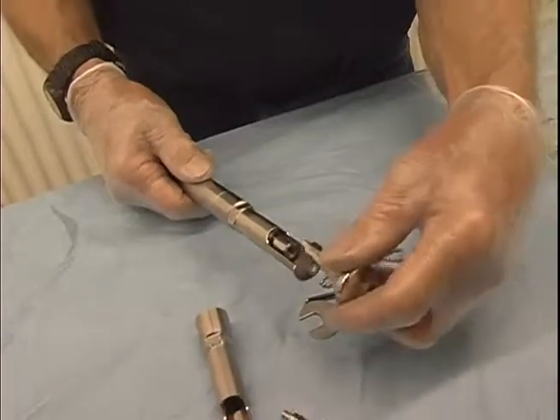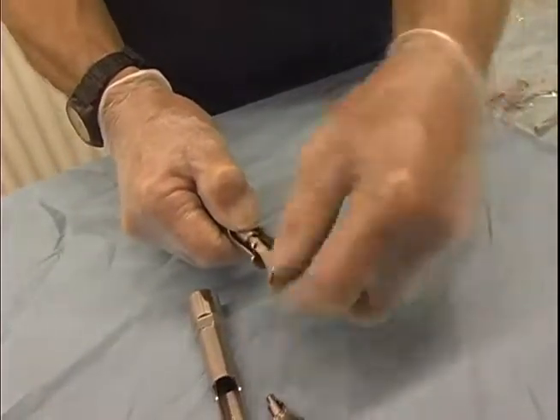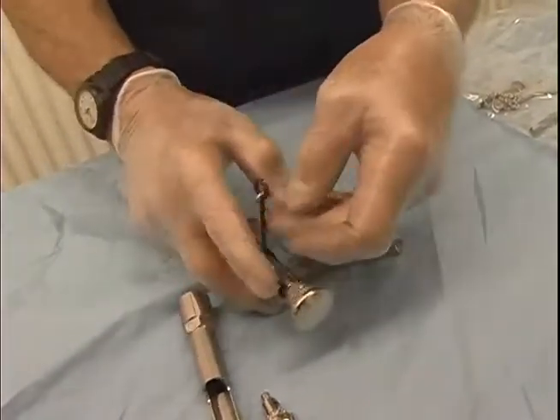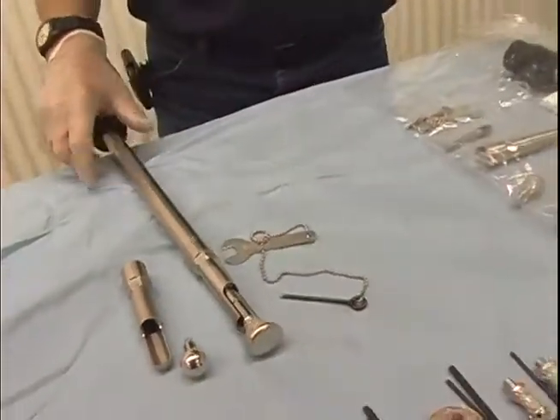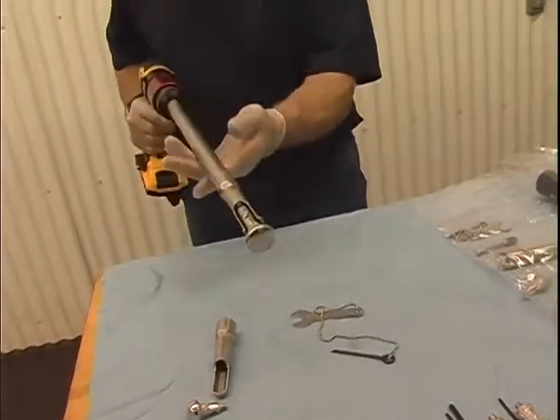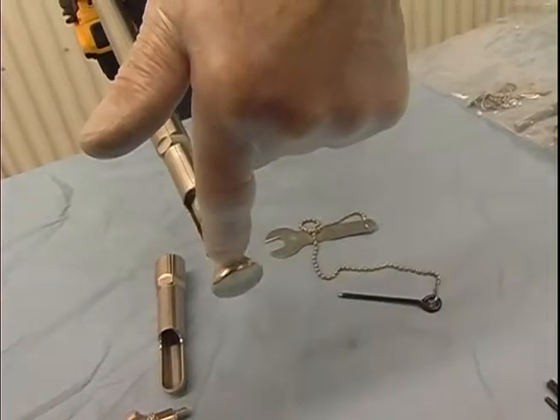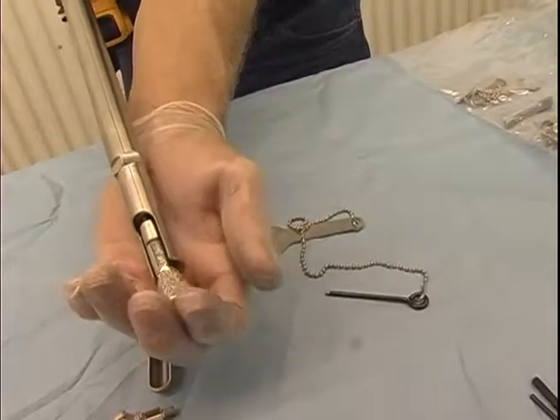And lastly, the flared end burr, the upper 11 burr, is tightened onto the attachment, finger tight, and this is ready to go. So this burr is smooth on the side that would come up against the mandible. So if this was the tooth, it would be burred against the caudal edge of the tooth here. It would be sitting behind the tooth, and this part would be smooth against the mandible.